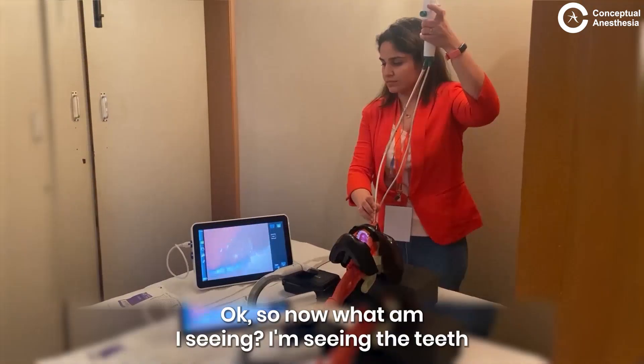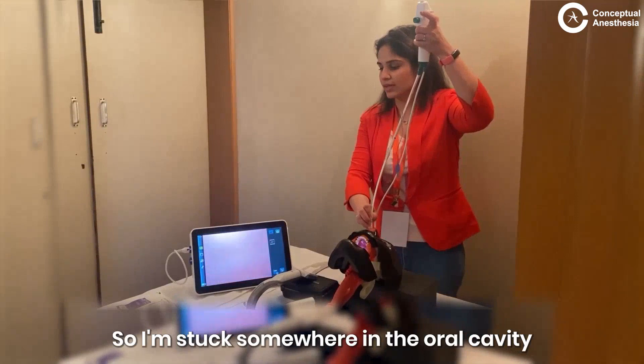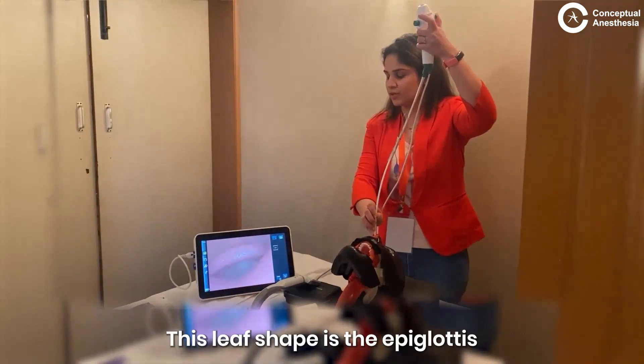Now, what am I seeing? I am seeing the teeth, so I am stuck somewhere in the oral cavity. I withdraw a little bit and I come here. This leaf shape is the epiglottis.